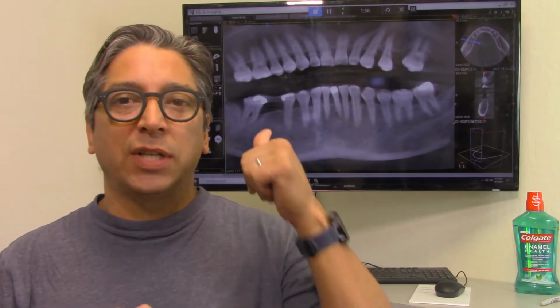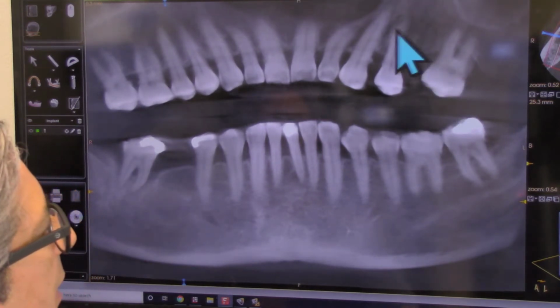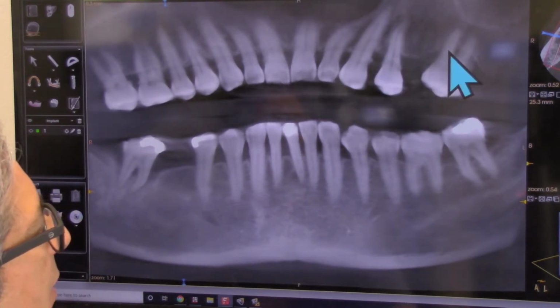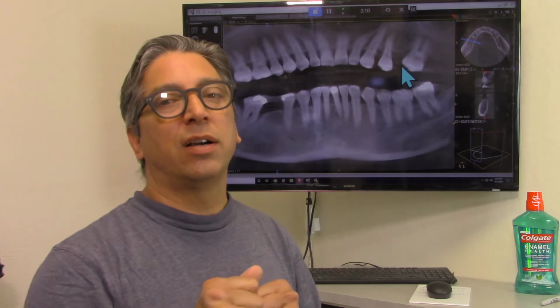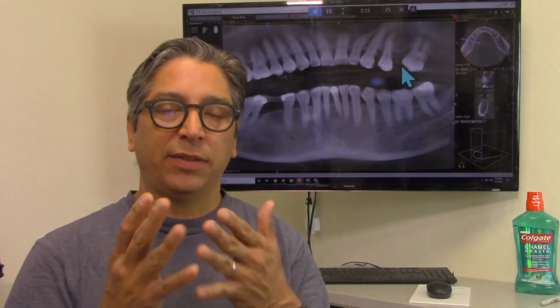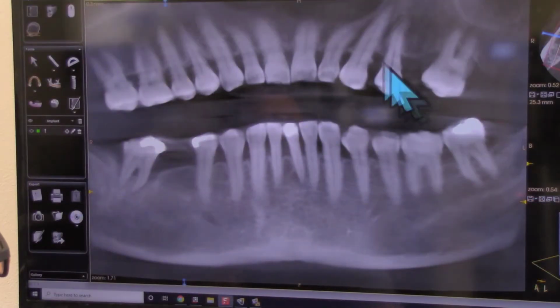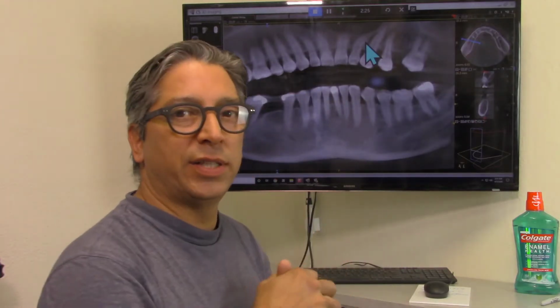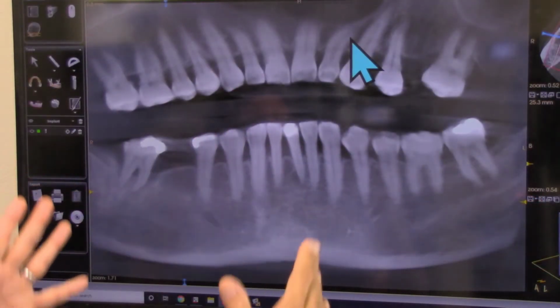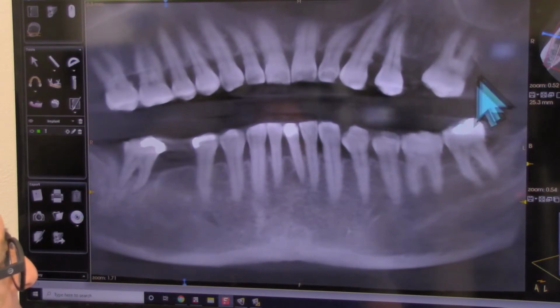When we look at the upper left side on this case, right here, we're looking at an edentulous site. And that means that this patient had some years ago lost a tooth there. And what happens to that? Well, teeth do move, and over time they've drifted. And you can see how it kind of opened up the gap. Don't look at this part. This is just a distortion in the CT scan, the way it was spread out, because we're really looking at the bottom here. But this just illustrates the gappage that has occurred where this tooth is now angling in and these teeth are spreading out.